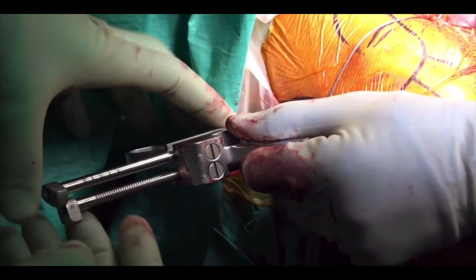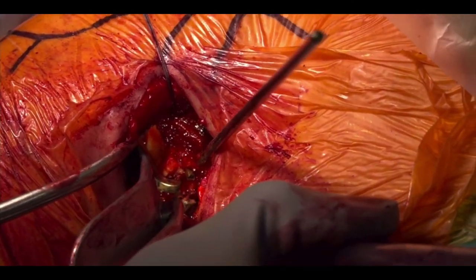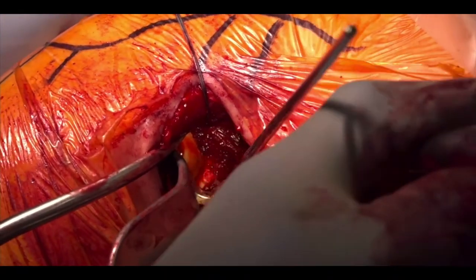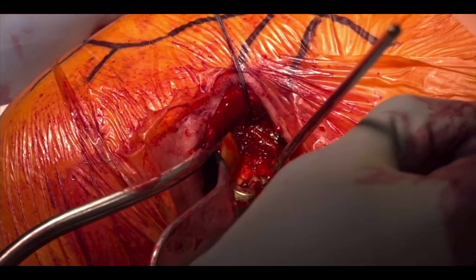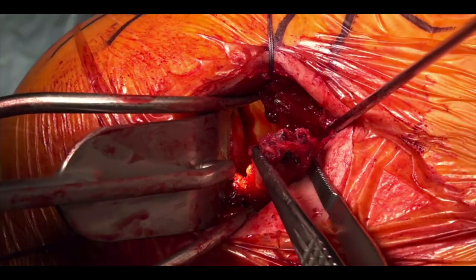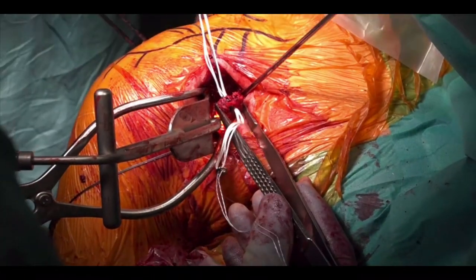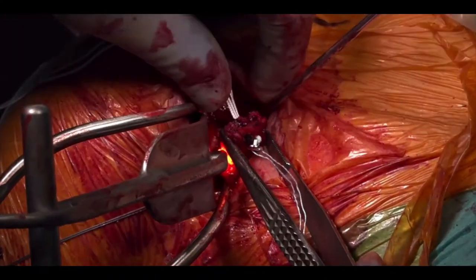The rest of the guide is assembled posteriorly and the drill bullet is inserted down onto the back of the glenoid. The superior and then inferior sleeve drill guide is then inserted from the back. You can see the two drill sleeves positioned above and below the drill guide anteriorly on the front of the glenoid. The prepared coracoid is then flipped back up into the operative field and the superior and inferior suture buttons are inserted and docked into position.